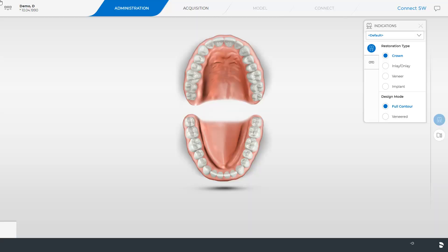We are in the administration phase of the Connect Software 5. At the right edge of the screen, we determine the restoration type and the design mode for our case. Then, we set the position in the odontogram.